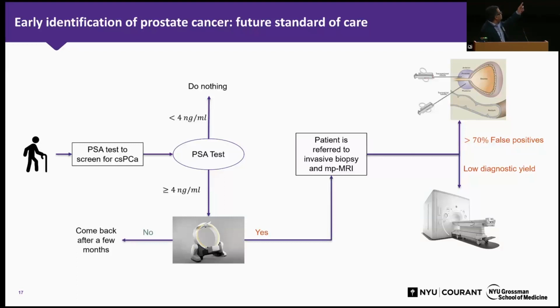Now, if the accuracy of the scanner is as high as the accuracy of the scanner on the right, except that it's just not generating an image, I would argue that this would really reduce your biopsies and also increase the diagnostic yield of the imaging that the radiologist sees. Right. Which ties back to Andrew's case: when you have such a low field scanner, in this case also equipped with AI, it matters a lot what the use case would be. And there are plenty of such use cases within the healthcare pipeline.